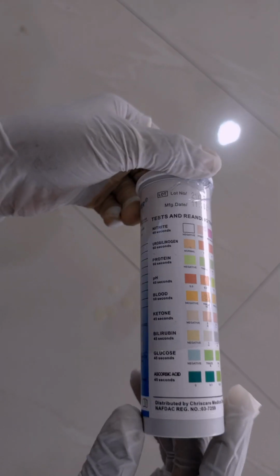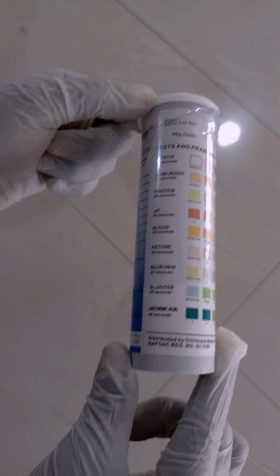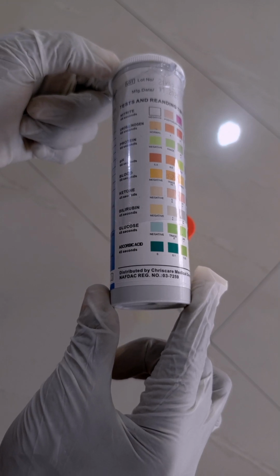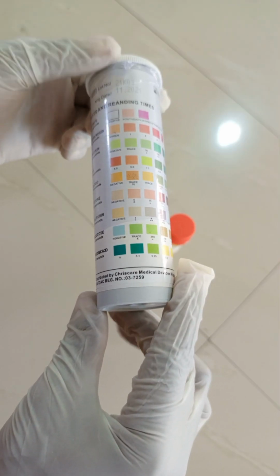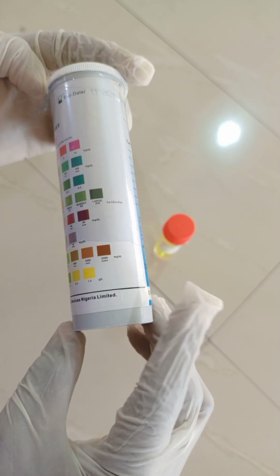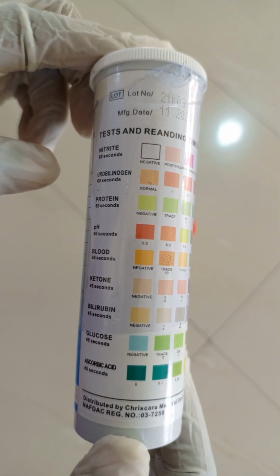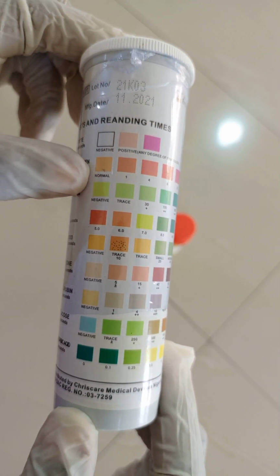Okay, so this is a closer look at the urinalysis chart or the container of the urinalysis strip. We call it dipstick. So if you look, there are 9 parameters here. This is for Combina. Okay, and if you check, there are color differences. There are color grades for each analyte. Looking closer at it, you can see that the very first one here is nitrite, and the first box there writes negative, followed by positive.